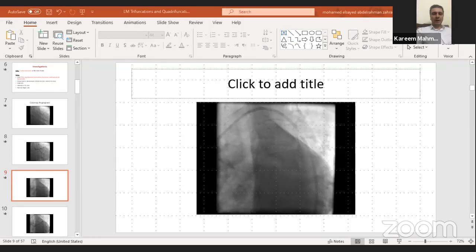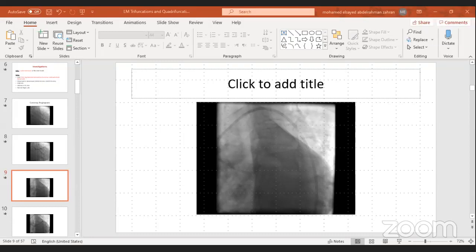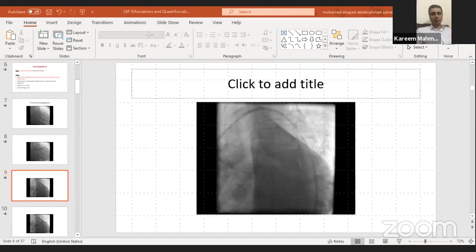The use of an open cell stent is mandatory, and the liberal use of kissing balloon, as you will mention, and the final POT is also very important because, as you mentioned earlier, with every effort we do for improving the long-term outcome in this kind of patient, these patients still have a worse long-term outcome as compared with the regular left main bifurcation technique.